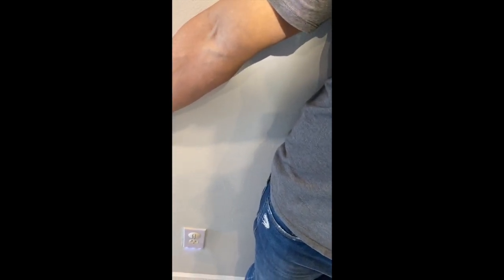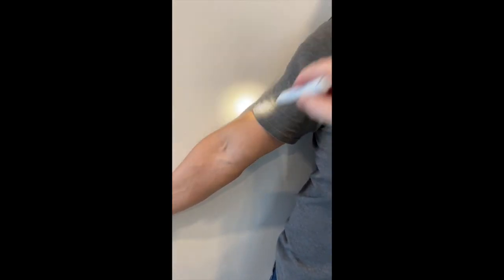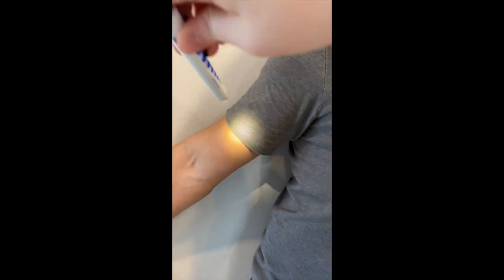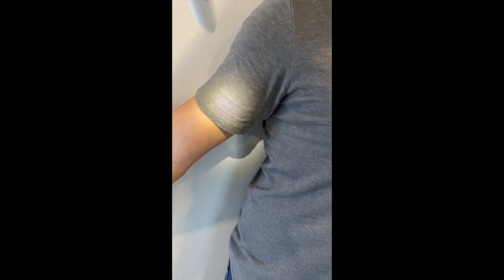You want to make sure that you include the elbow and the shoulder joints — shoulder joint, elbow joint. Our central ray is going to be midline to the mid-humerus, so your central ray should be around here, that would be mid-humerus. It's going to be taken at 40 inches SID.